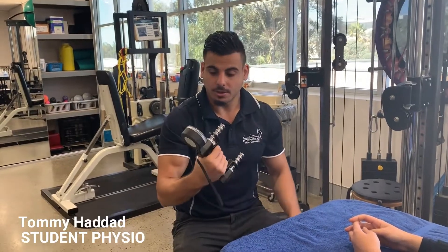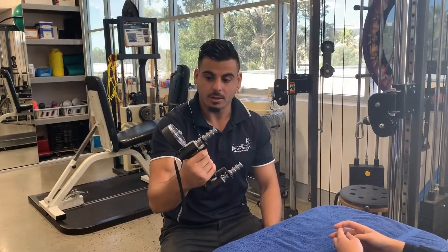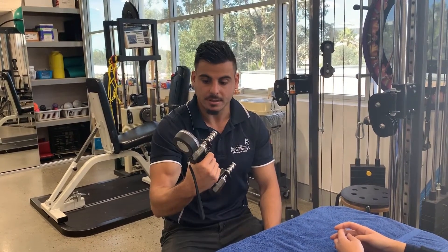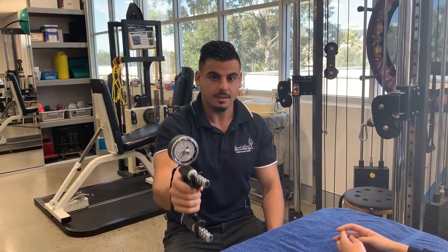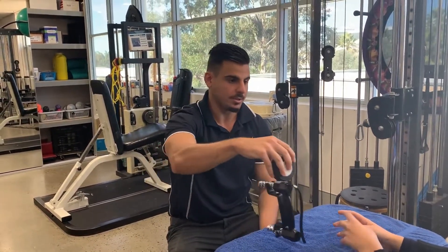Hi guys, today we'll be showing you what we utilize to test a patient's grip strength. This is a dynamometer — by squeezing this device you can get a reading of how strong a patient's grip is.